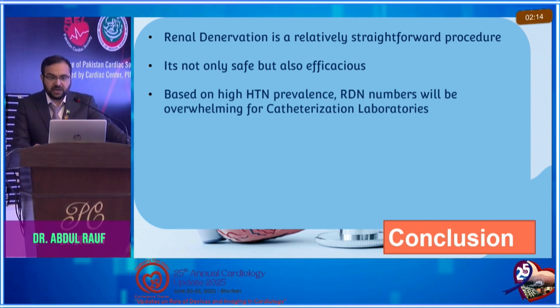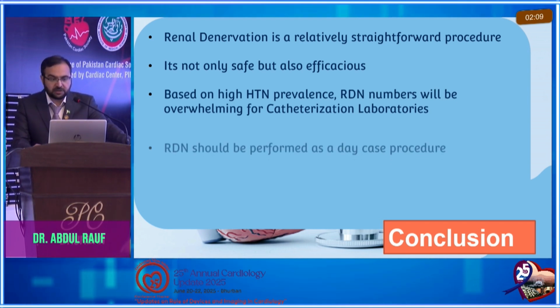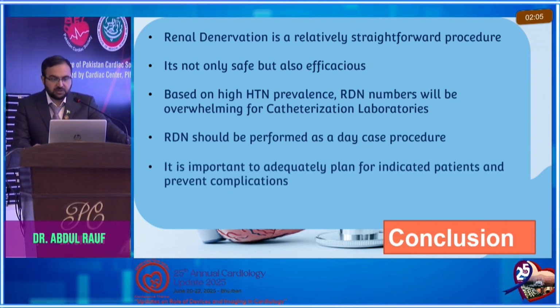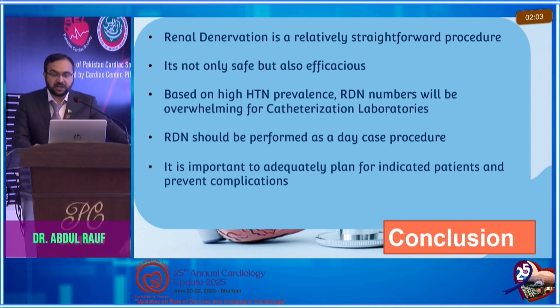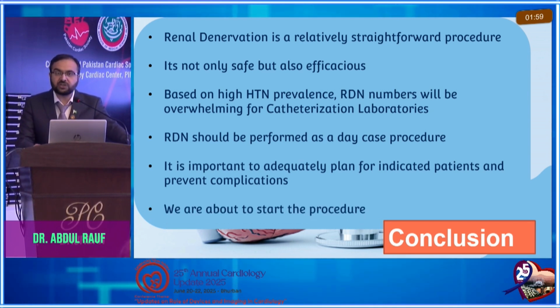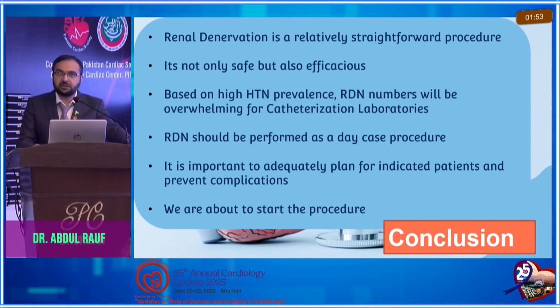Based on the high prevalence of hypertension, in the future RDN numbers will be overwhelming for catheterization laboratories, and RDN should be performed as a day case procedure. It is important to adequately plan for indicated patients and prevent complications. We are about to start the procedure next month, inshallah. All the patients have been screened, and we plan to do 5 cases in Pakistan.